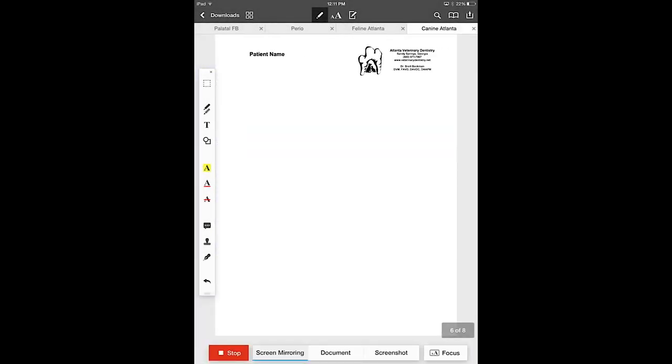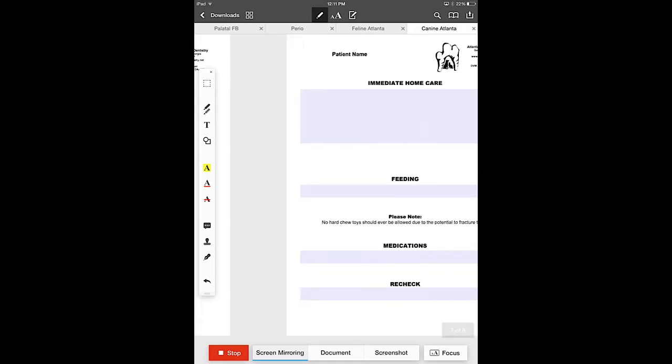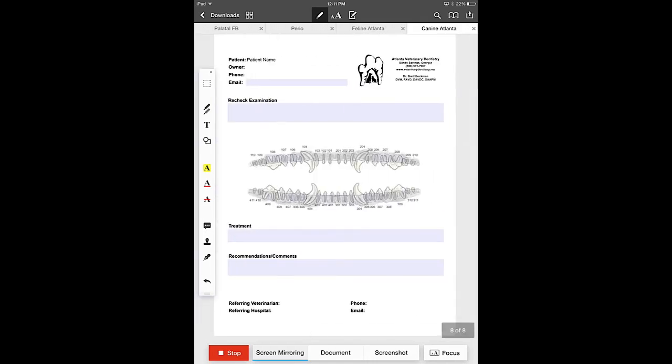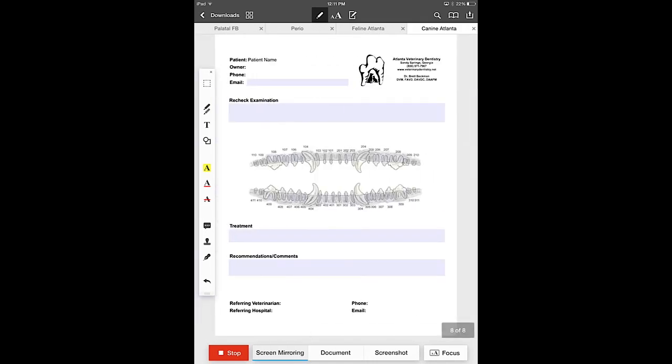The next page is a blank page which allows us to do some pretty incredible things as well. And we'll get back to that in a second. This is the discharge page and this is the recheck page.